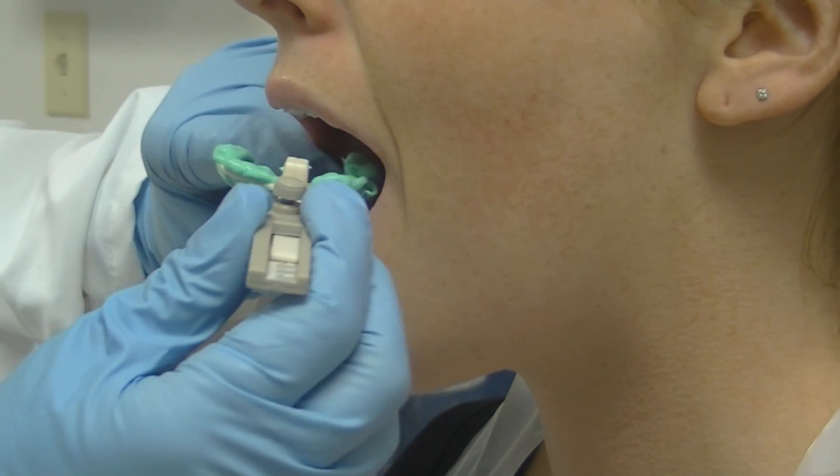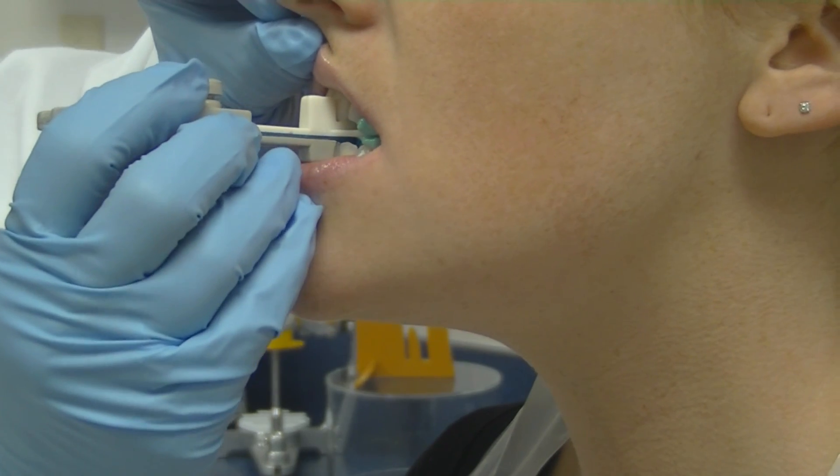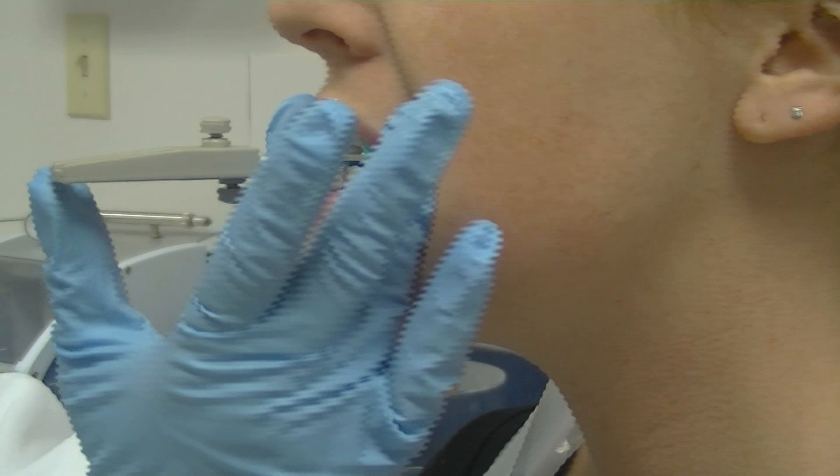Once the material is loaded onto the fork, simply place it in the mouth, remembering to line your midlines up with the line that is marked on the fork itself. Remember to record where you took the bite registration, as you will need to refer to it for your baseline records.